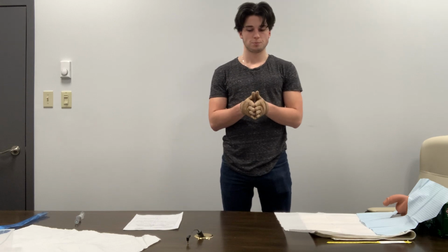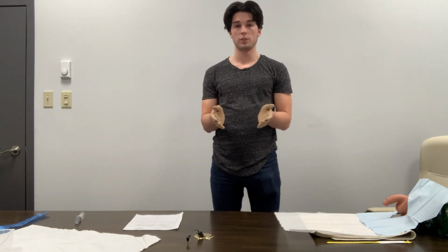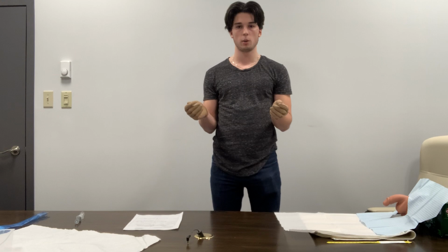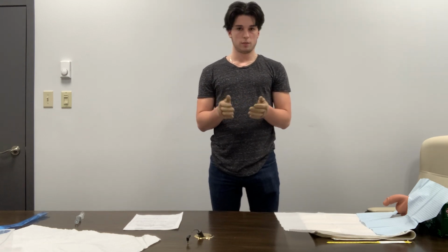go document. For documenting the removal of the catheter, I will document that I removed a 14 French catheter, as well as the 10 milliliters of sterile water, and the tip was intact with no blood, so it was easy to remove. The patient tolerated the procedure very well, and the patient is due to void in 8 hours. That is the completion of the removal part.